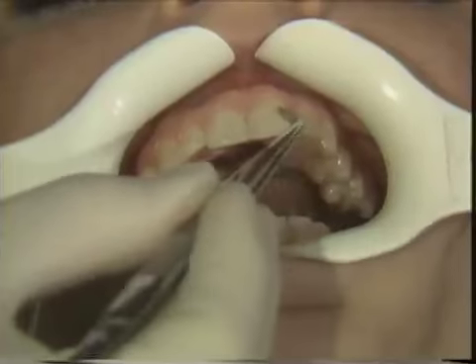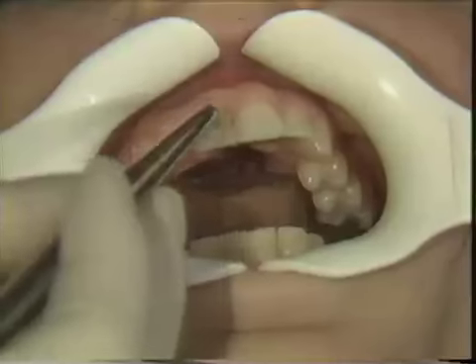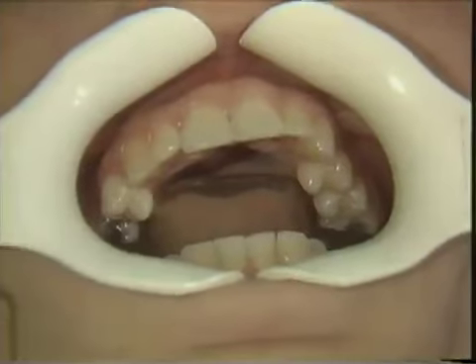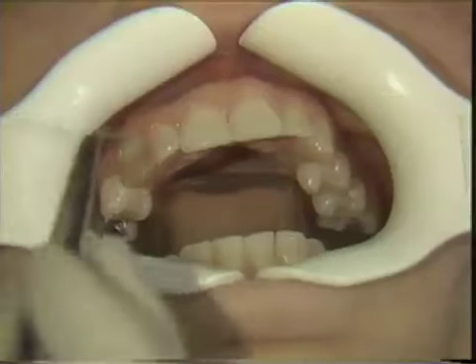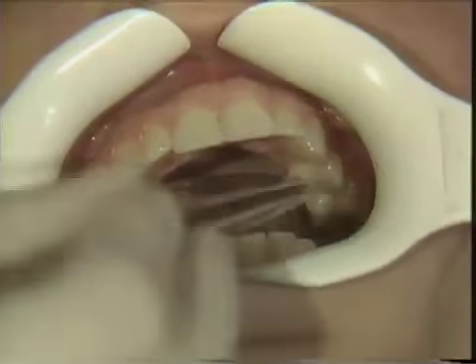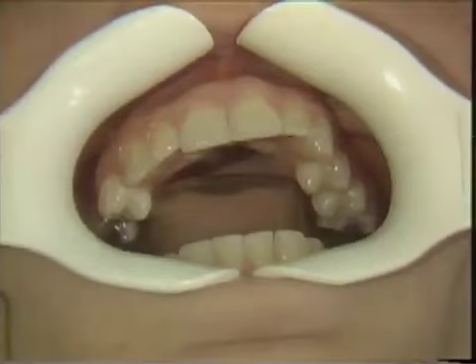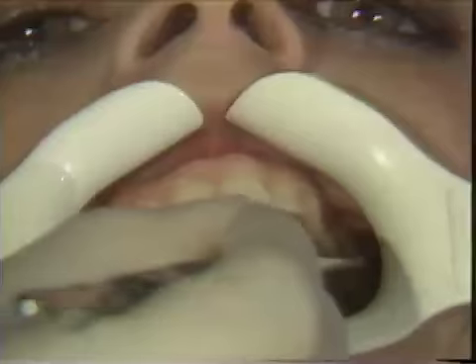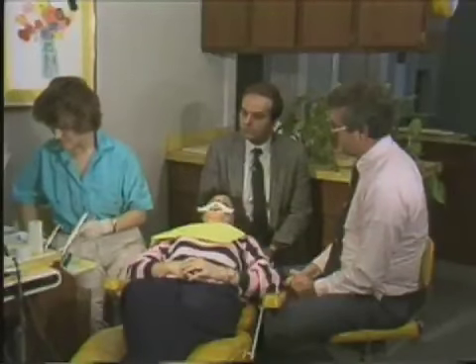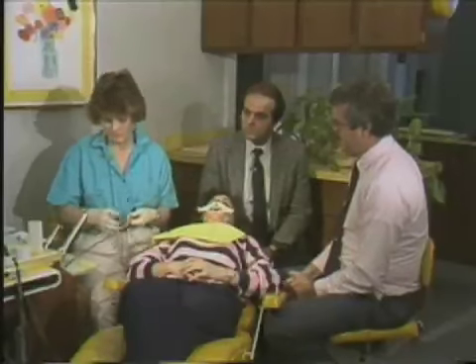In this instance, we're not acid etching the one lateral because the lateral has a composite restoration on that, and we're going to treat that a little bit differently than we would. Now spend 60 seconds.